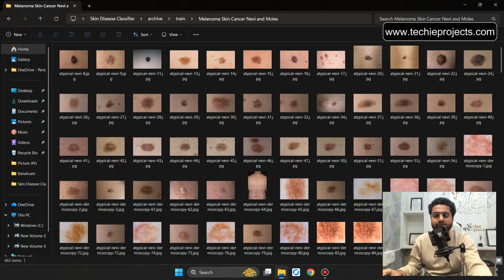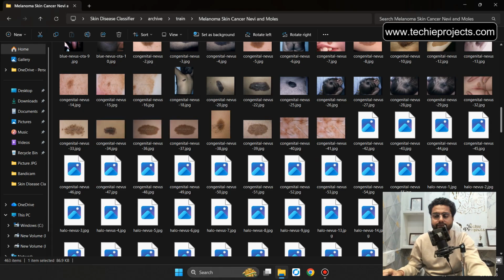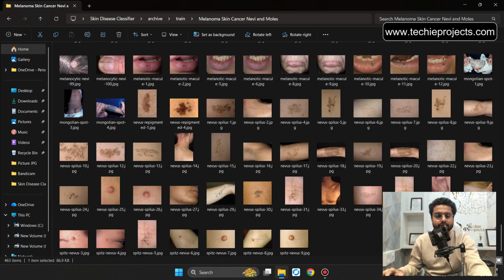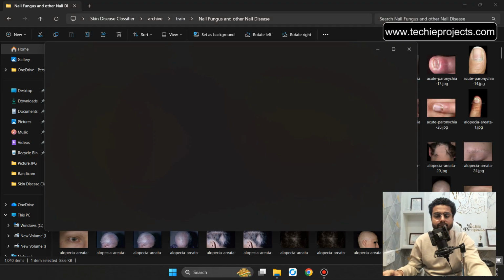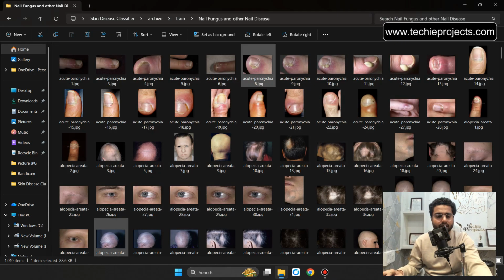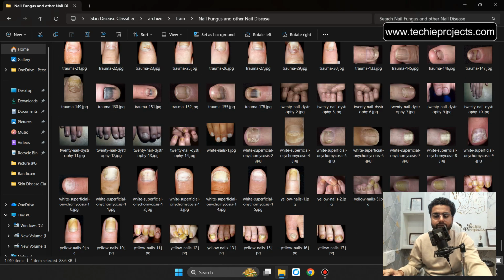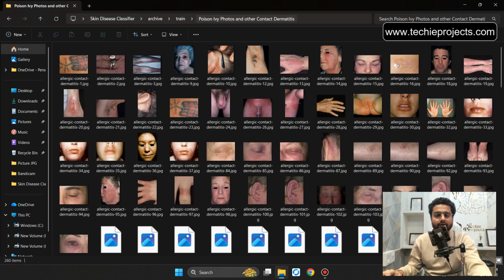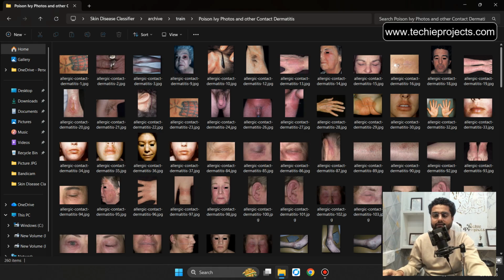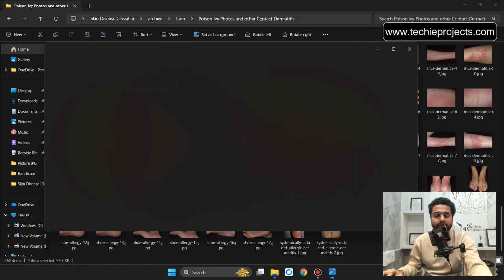Melanoma, skin cancer, nevi, and moles. Let's open any of the images. It will be a type of disease. Let's go back. Now nail fungus and other nail disease. It will be around 1040 images. Let's go back. Now poison ivy photos and other contact dermatitis. Let's scroll down. It will be around 260 items. Let's open any of the images.